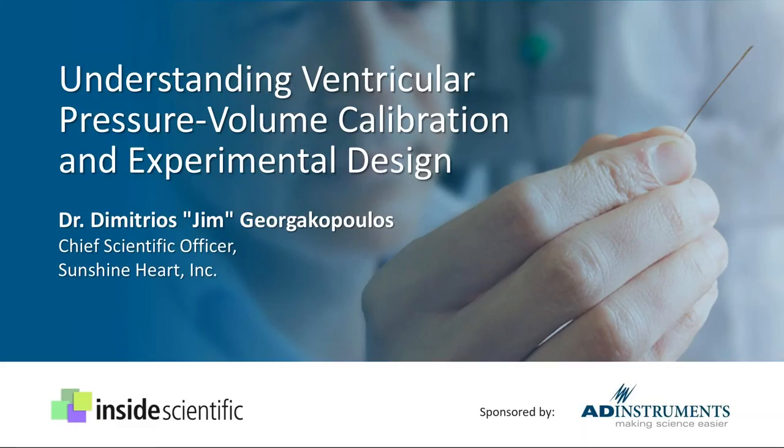In his current position, he is engaged in the development of a device targeted to assist the failing heart in advanced heart failure patients. Specifically, the device consists of a cuff which is wrapped around the ascending aorta, providing chronic counterpulsation. Interestingly, they believe that some of the effects of mechanically compressing the aorta may be due to aortic baroreceptor stimulation. Therefore, they are employing PV loops to separate the effects on the heart and coronary circulation from the peripheral vasculature.